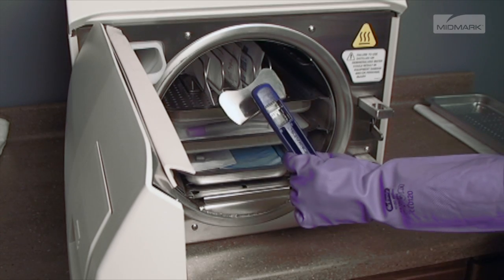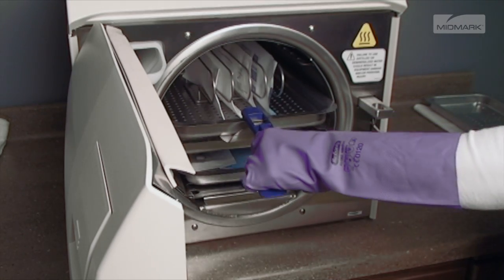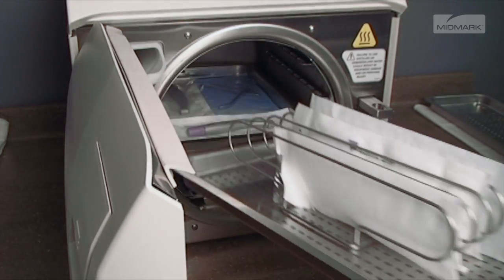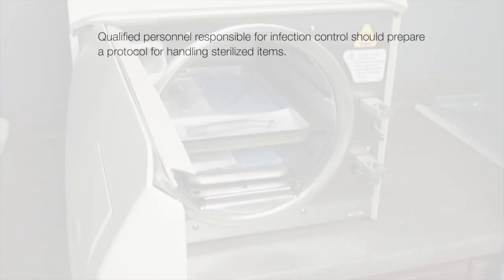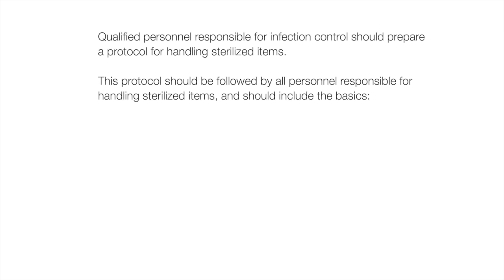Remove trays and cassettes using the Midmark Approved Tray cassette tool. Hold the tray level and slightly elevated to prevent it from shifting and becoming dislodged. Qualified personnel responsible for infection control should prepare a protocol for handling sterilized items. This protocol should be followed by all personnel responsible for handling sterilized items and should include the basics.